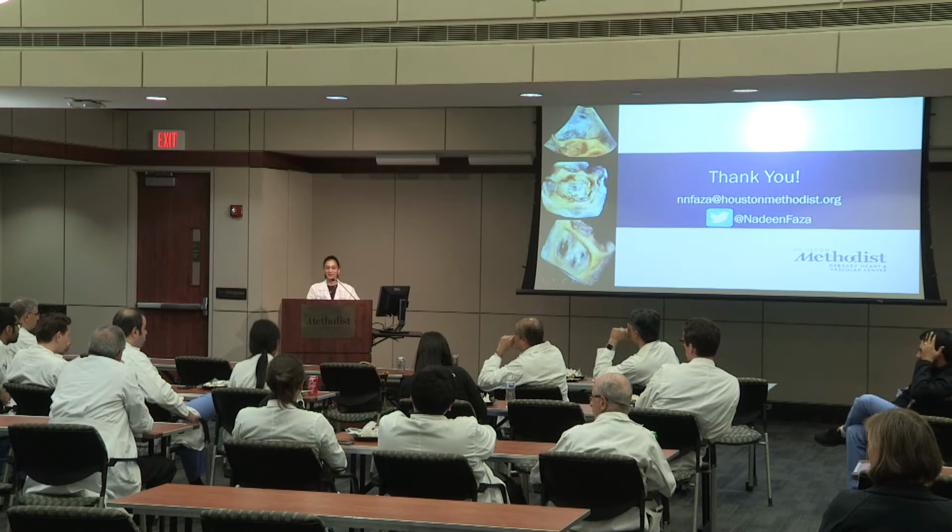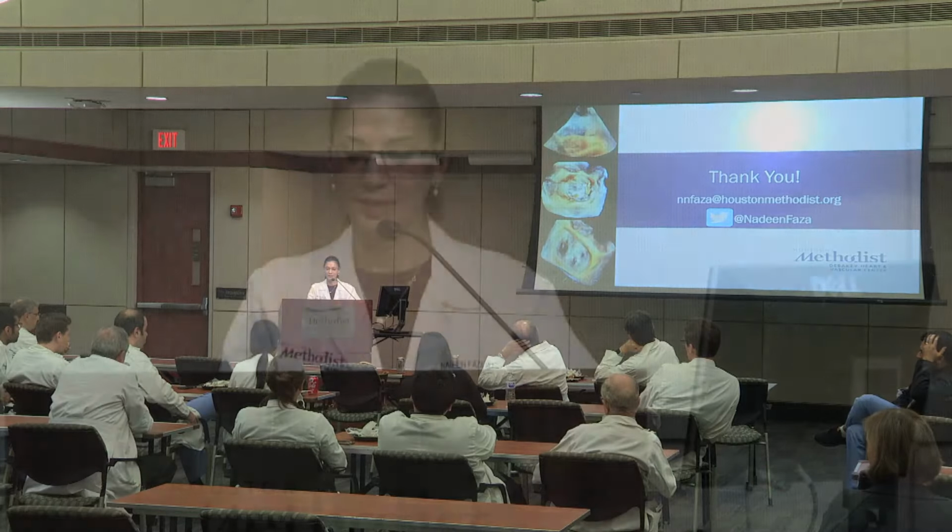I agree with you. Optimizing it mainly, if the patient's in AFib, you want to do HVR, you want to increase the number of beats to get higher resolution. But what I find to be most useful is when you have a pathology, you want to see where the regurgitant jet is coming from. Post-processing in terms of calculating a vena contracta area is a useful application. But I do see how it's not as clear-cut or clear when you're just using 3D color.